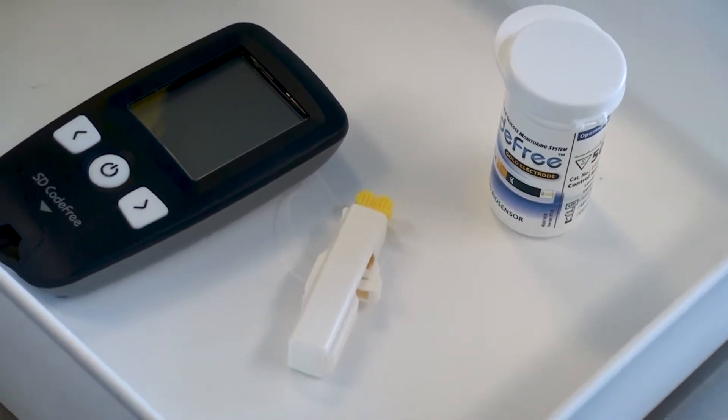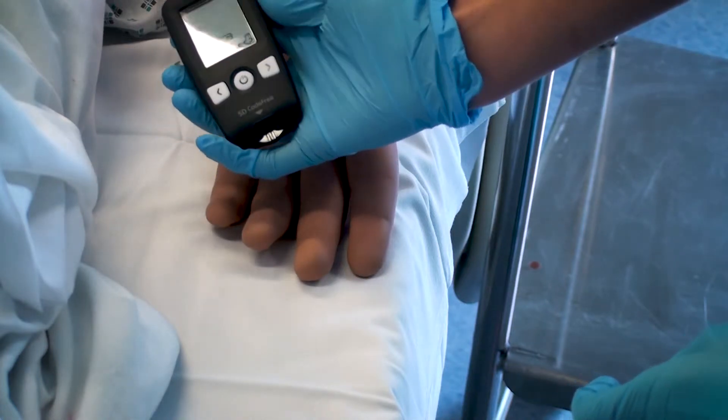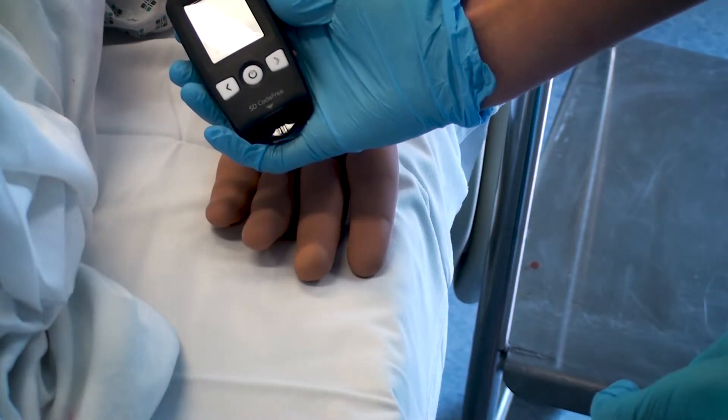Ensure that the test strips are in date and you have the correct strips for the meter you are using. You must also ensure you're competent with the device used as some clinical areas may use different devices.